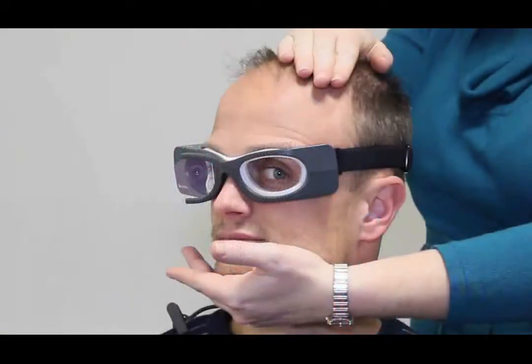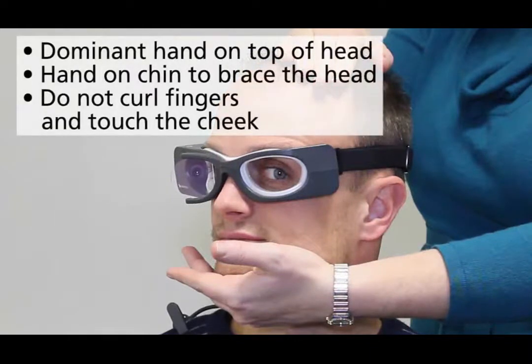You don't want to curl your fingers up the side of the cheek, because then you could actually be moving the cheek, and any movement of the cheek could possibly move the goggle. You just brace your hand under the chin and then the other hand on top of the head.